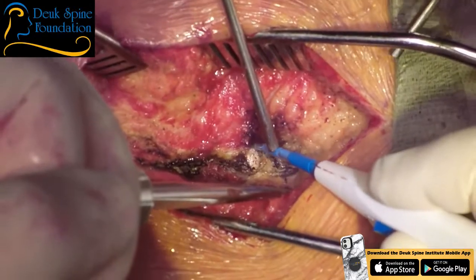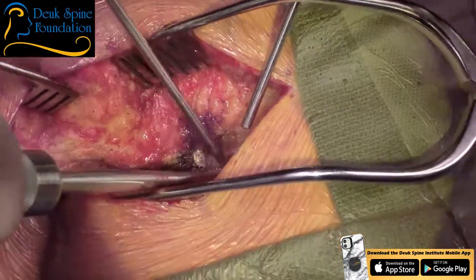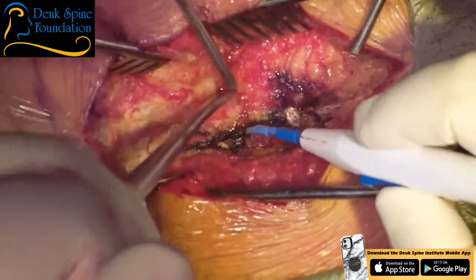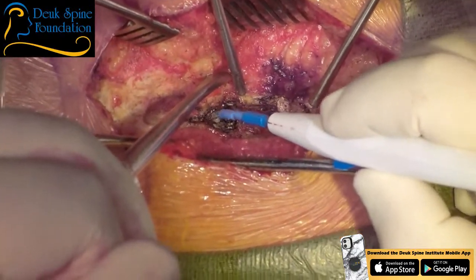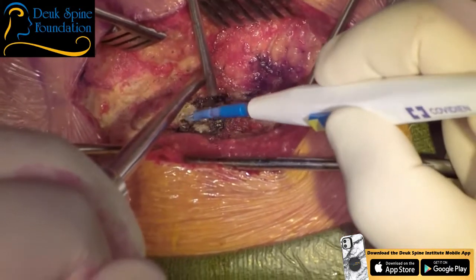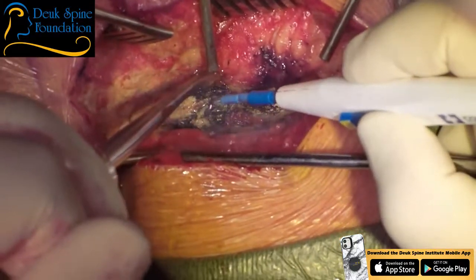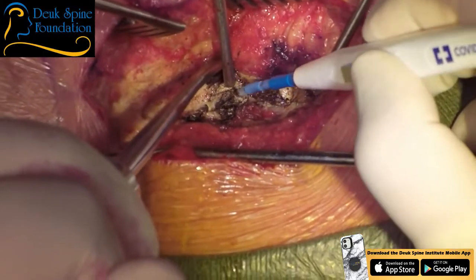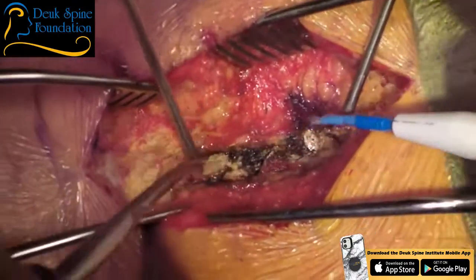I think dead muscle is one of the biggest problems from open spine surgery that we are neglecting. And most surgeons don't think about it. But it's actually the source of pain after surgery, the muscles. It's not the bones, it's not the screws and rods. It's quite literally the muscles being inflamed and spasming. So the more we protect the muscles during these surgeries with the posterior lumbar, posterior cervical, the faster the patient will recover with less pain.